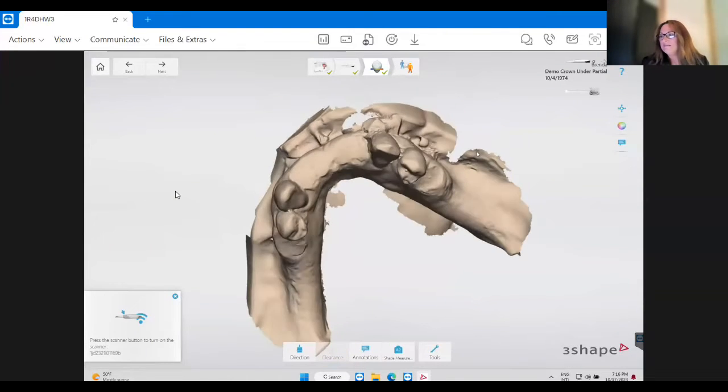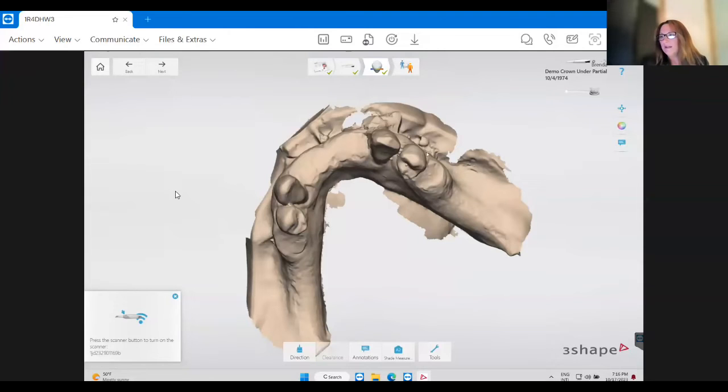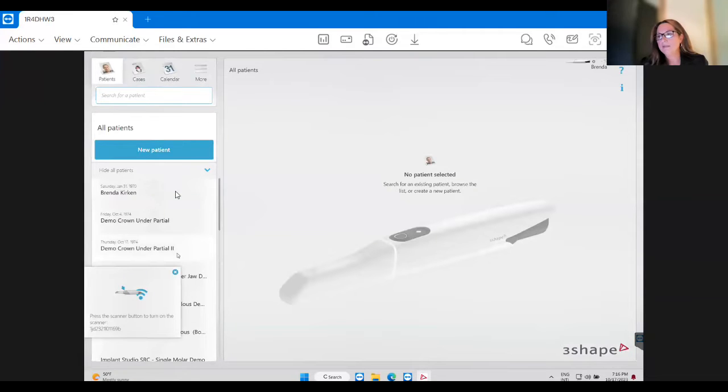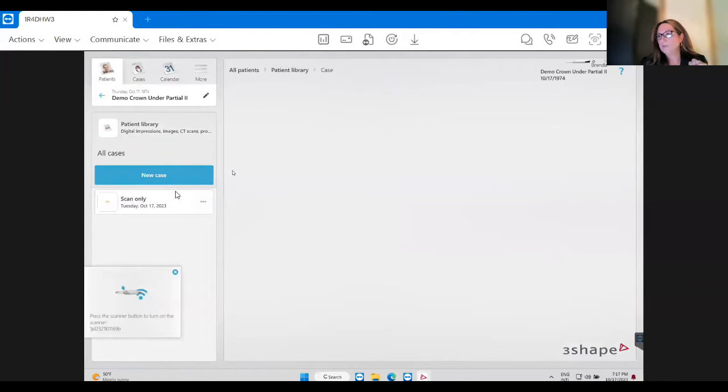This is an existing one that the lab allowed me to prep my very first tooth with a Dremel, mind you. This is a real case, right? Yes, this is a real case. So that is one way. Another way is if the tooth was so broken down, and I'm going to open this one.